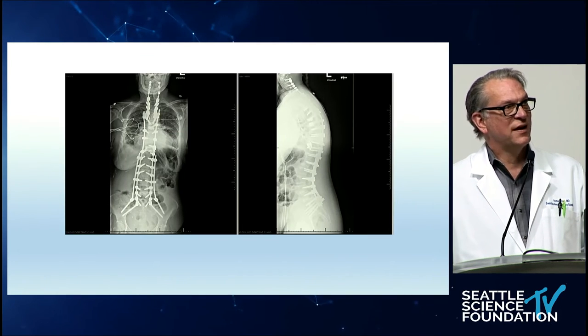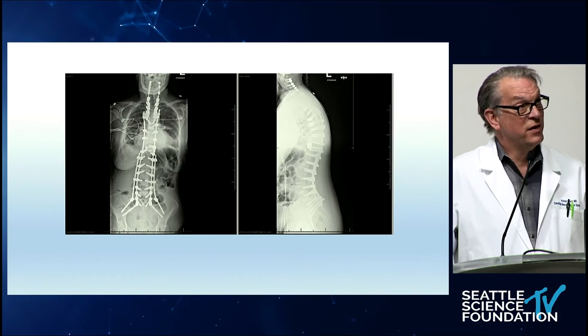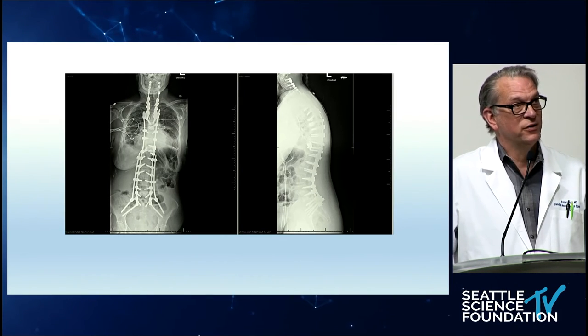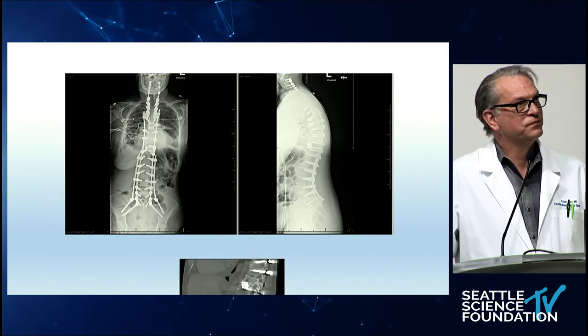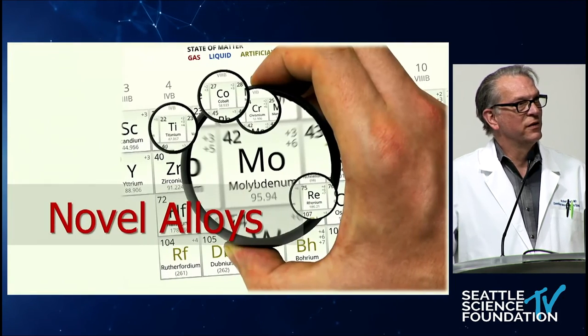And we did a second stage in her of ALIFs at L4-5 and L5-S1 below, where I did an extended laminectomy, and she actually fractured or tore the anterior longitudinal ligament at I think it was T10-11 or T11-12, and so we went in up there and put in an interbody graft as well. And this is what her CT looked like postoperatively from all of that.